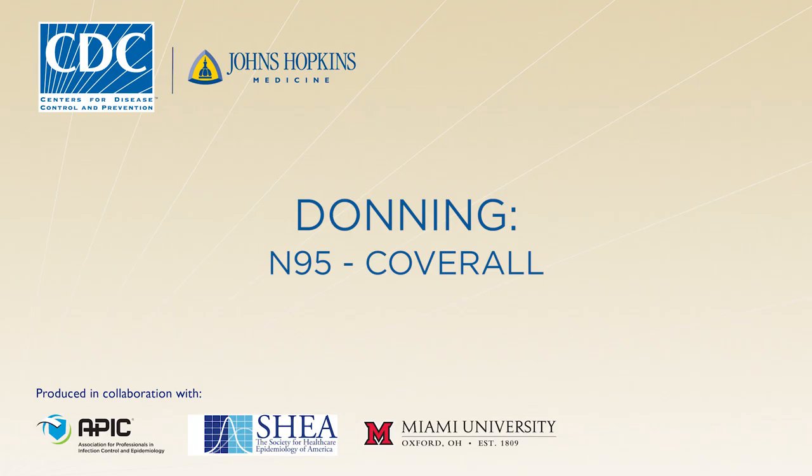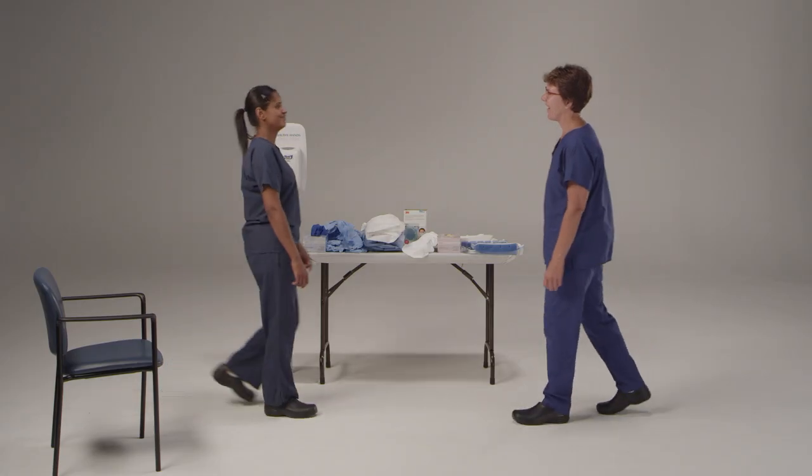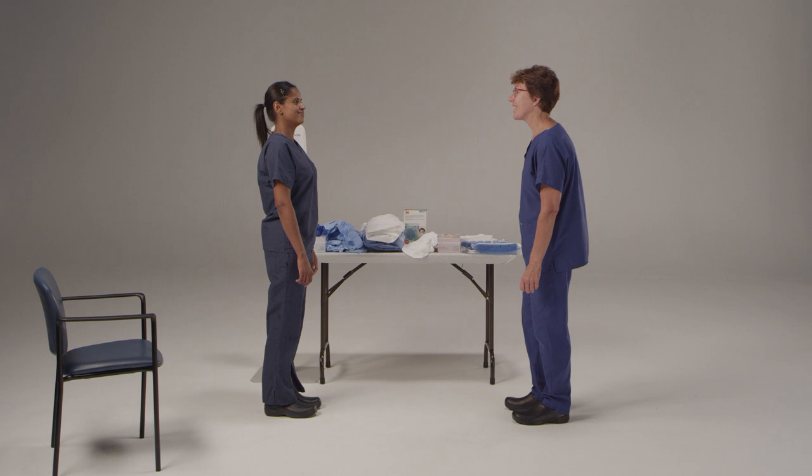This donning procedure assumes the facility has selected to use an N95 respirator with a coverall. An established protocol facilitates training and compliance. Use a trained observer to verify successful compliance with the protocol. The trained observer will read aloud to the healthcare provider each step in the donning procedural checklist and visually confirm and document that the step has been completed correctly. The trained observer in the donning process is a dedicated individual with the sole responsibility of ensuring adherence to the entire donning process, conducted under the guidance and supervision of a trained observer who confirms visually that all personal protective equipment is serviceable and has been donned successfully.